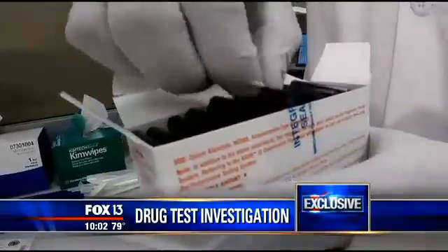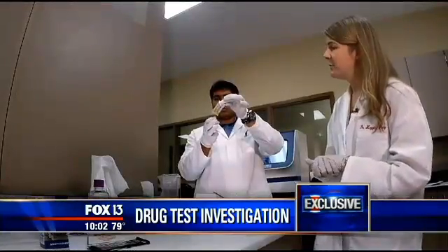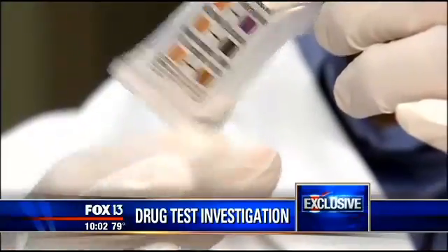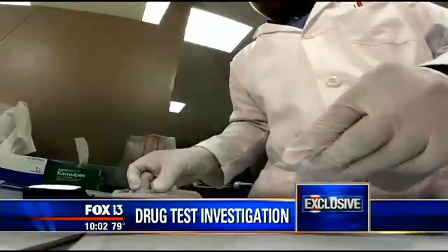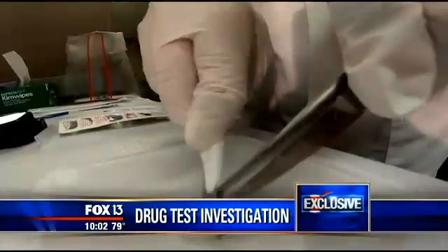10 exclusive new developments into our investigation of these field drug testing kits. We've been looking into these kits for 3 months now, how they work, how police use them, how innocent people can wind up in jail. Tonight at 10, Fox 13's Gloria Gomez takes us inside a lab where top scientists put these kits to the test. And these are experiments you've got to see to believe.